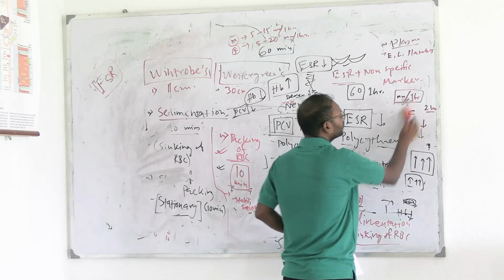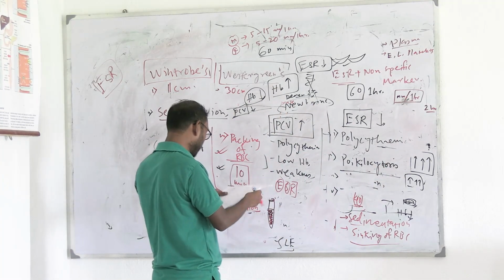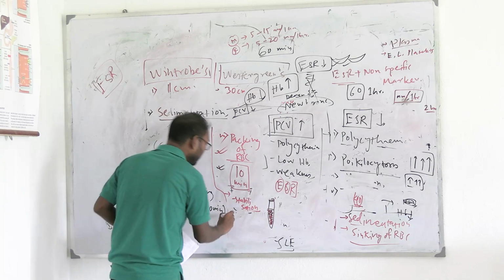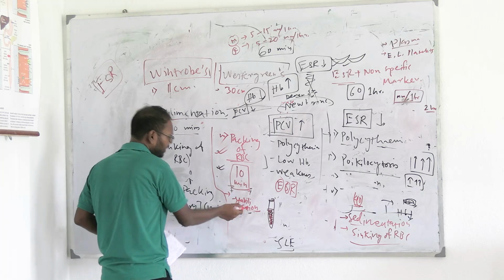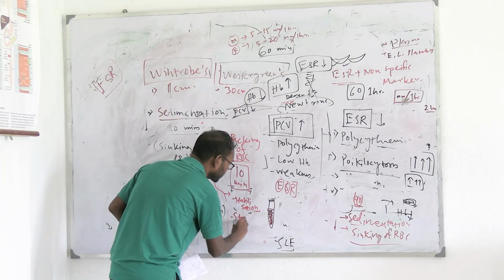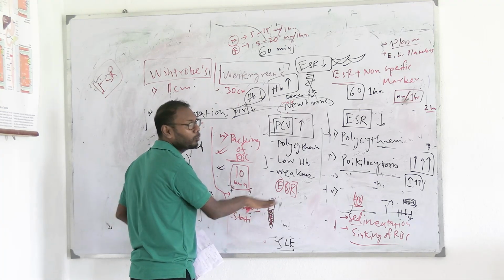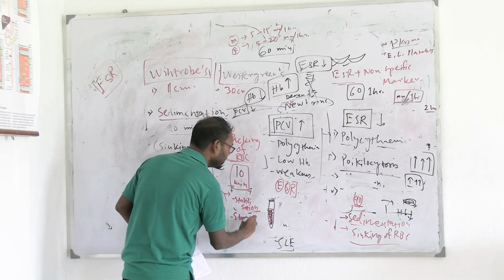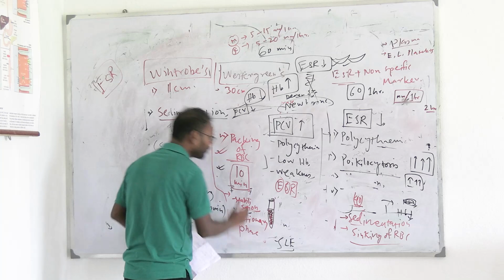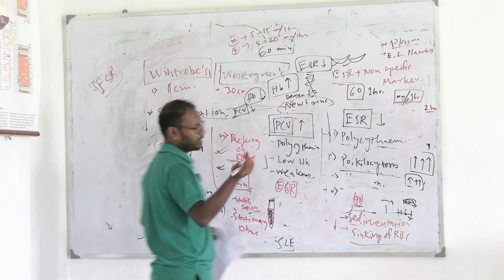After the sediments, all the cells have been packed and the sediments have been formed. Another name is there also, I missed it. The phases are stabilization, packing of RBC, and the other name is stationary phase. What I was trying to say repeatedly is that they are getting stabilized, packed, and they don't move after that. That means they are stationed below. So this is also called stationary phase, or phase of stabilization, or packing of RBC. Right.